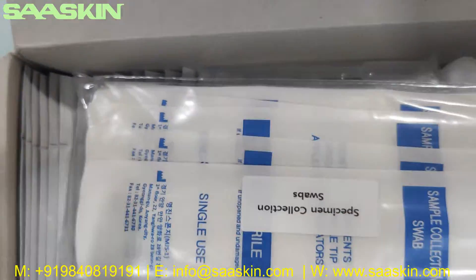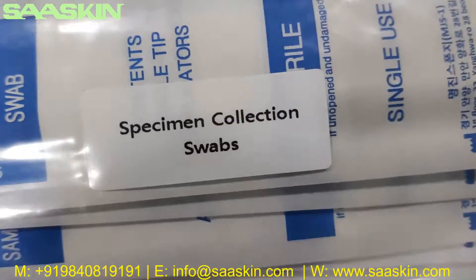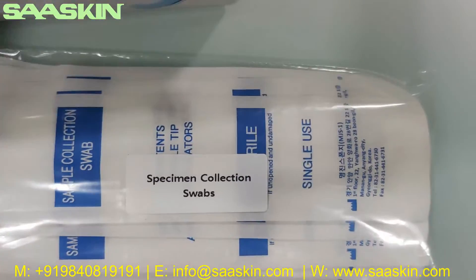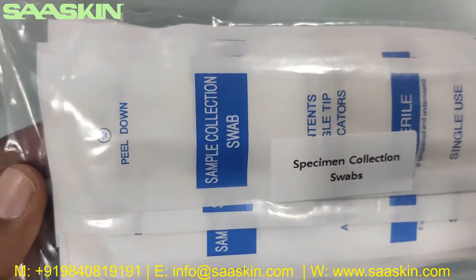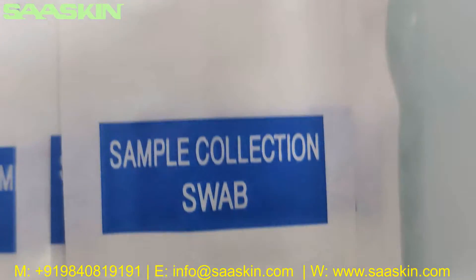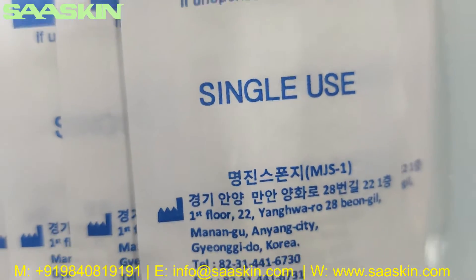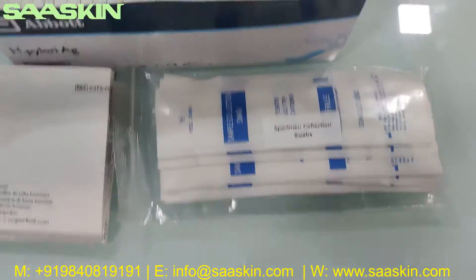If you go further inside the box you can see there are 20 specimen collection swabs. That's what the swabs look like — they are individually packed. You can see the swab stick. It's a 20-pack. It says sample collection swab. You can see it's sterile and single use. So you have 20 pieces of specimen collection swab.